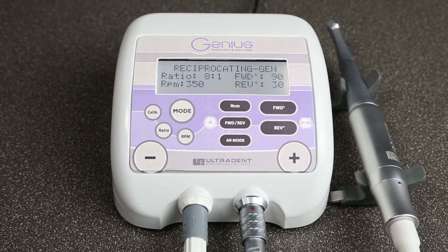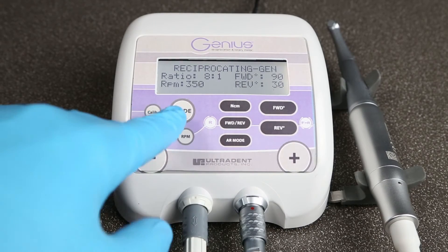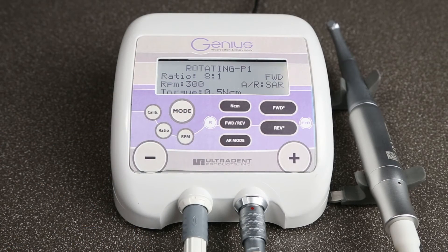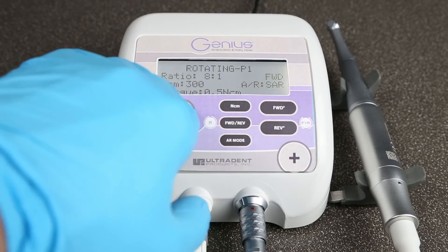With the Genius system, you have the safety of reciprocation at 90 degrees and 30 degrees, and the efficiency of rotation at 360 degrees, all within the touch of a button.